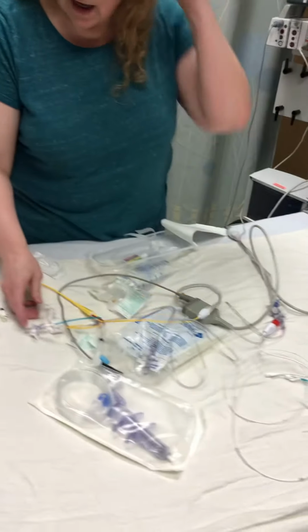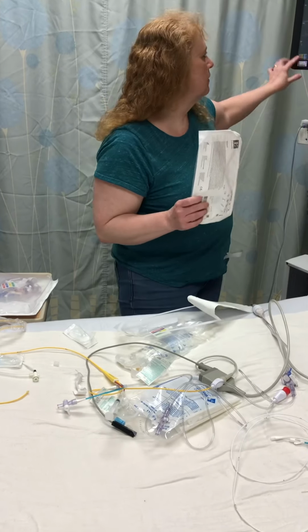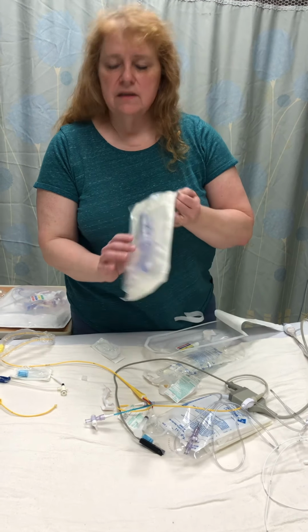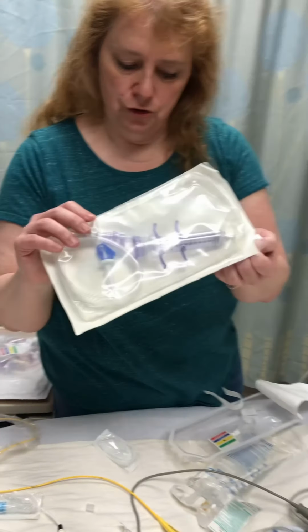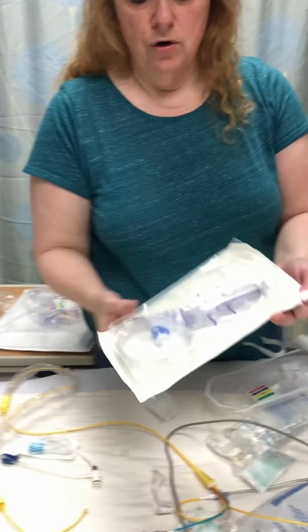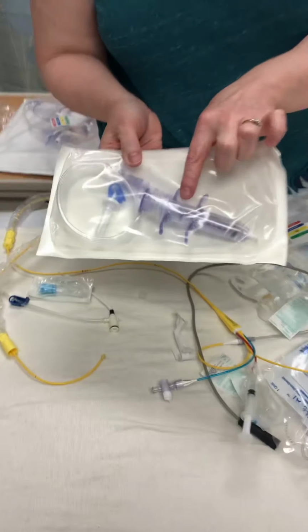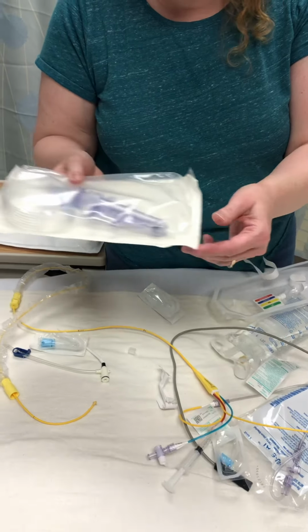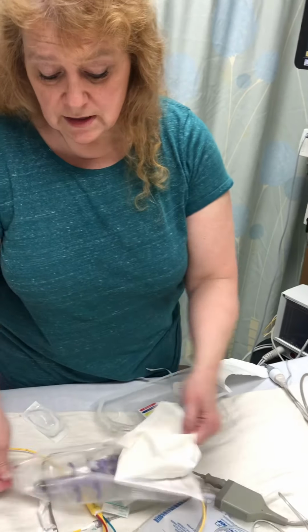When you're doing a cardiac output with the manual, annoying, you need this thing called a coset. And this is what you're going to do to get your cardiac outputs. You're going to inject the fluid with this syringe into the blue port. I'm going to show you how to set this up because it is a little bit different. You open this thing up.